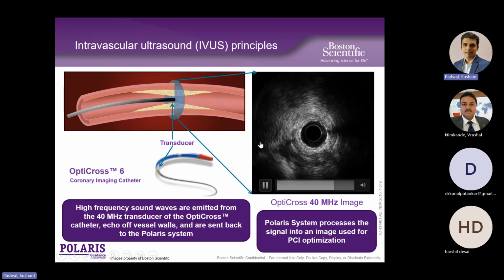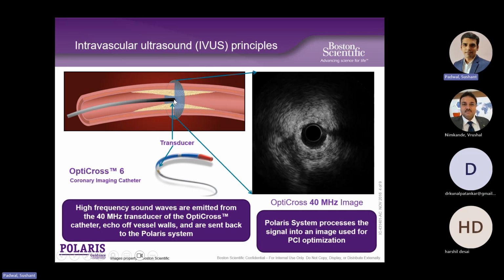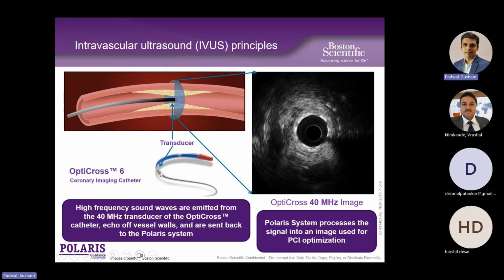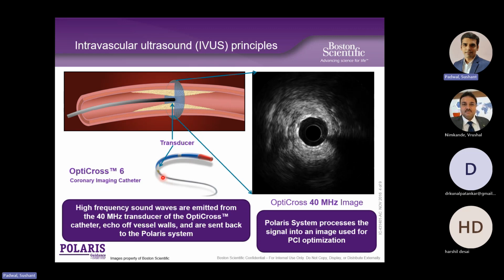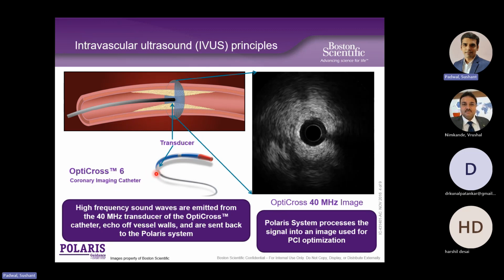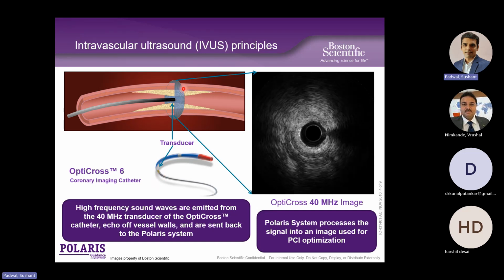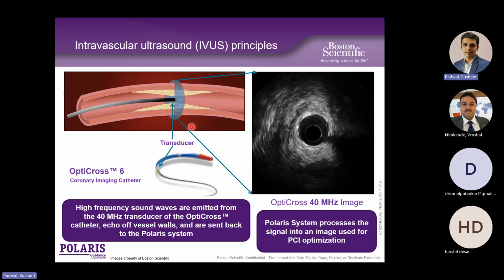So our ultrasound IVUS catheter has an ultrasound transducer at one side. It is not mounted throughout the catheter. Just a moment, I'll just show my pointer. As it is shown in the picture, it is there near the 20 mm from the catheter tip. Okay, you have your second marker. So that is your ultrasound transducer, and it fires and rotates at 1800 RPMs to generate an IVUS image.